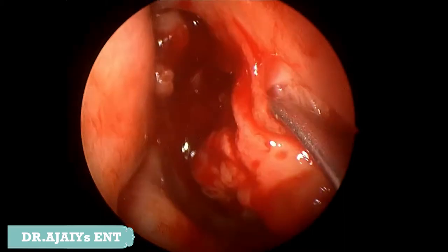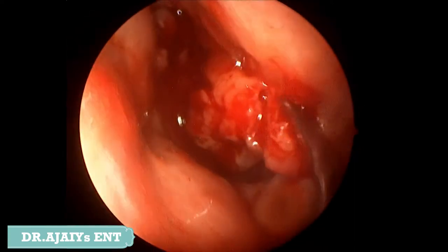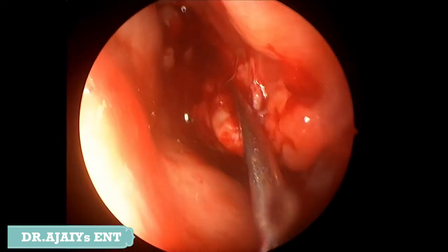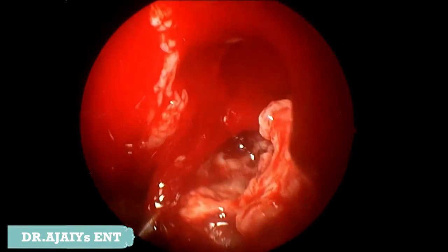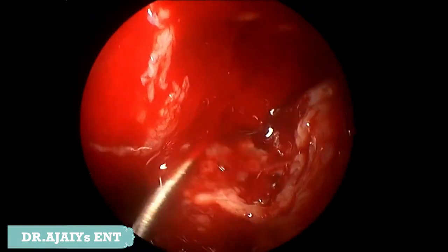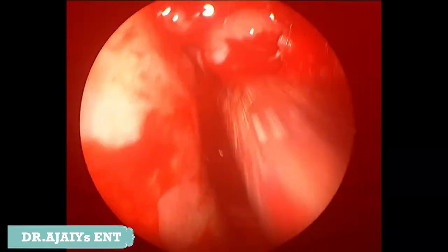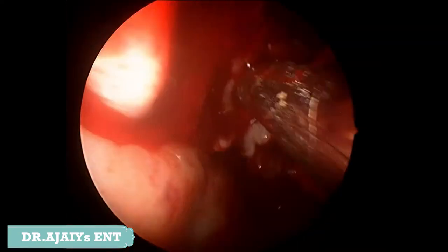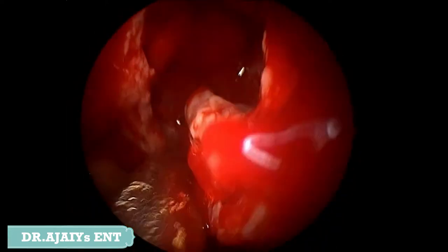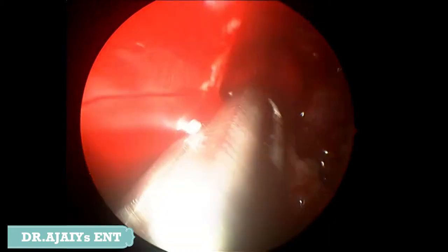On MRI we found fungal sinusitis. We did a middle meatal antrostomy and could see fungal contents along the floor of the maxillary sinus, not exactly in the central area. So we did an inferior turbinectomy and a modified denkers approach, removing the entire medial wall of the maxilla. We could see white fungal material along the contents of the maxilla, with necrosis of the medial wall and visible fungal contents.